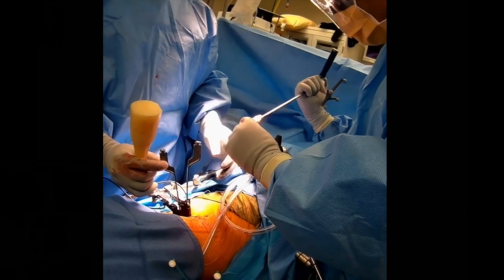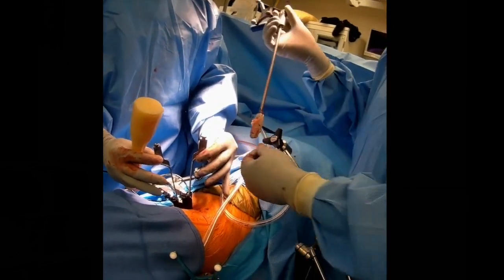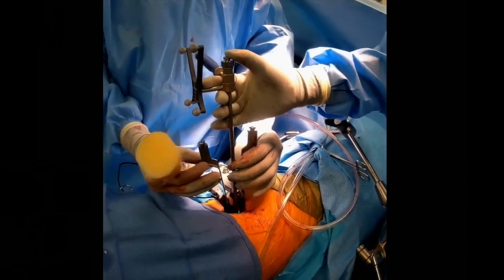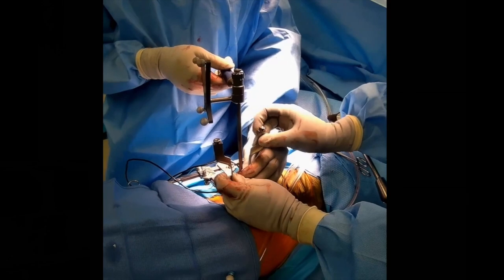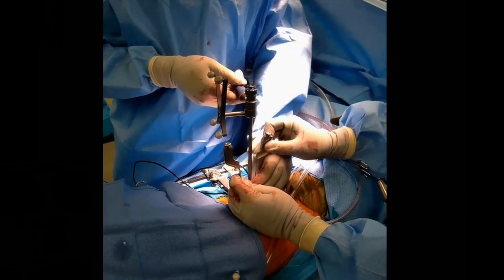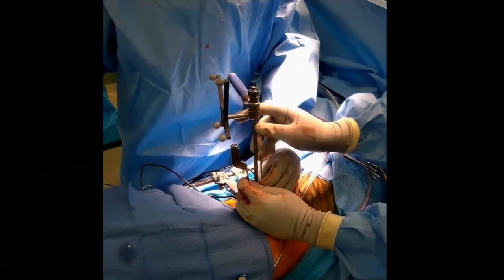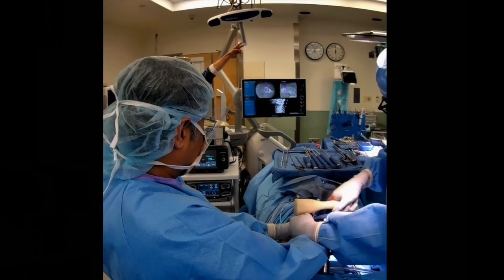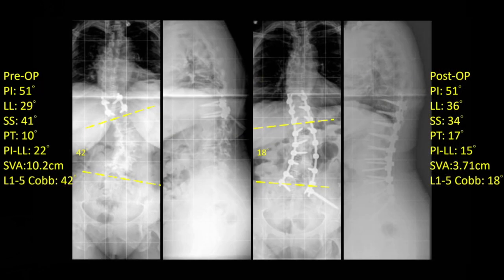This is the implant itself, filled with graft material for arthrodesis. Metallic slides are used in order to protect the end plates as the implant is going in. This not only protects the end plates from violation but it also contains the graft material. A post-operative CT and x-ray demonstrate the construct.